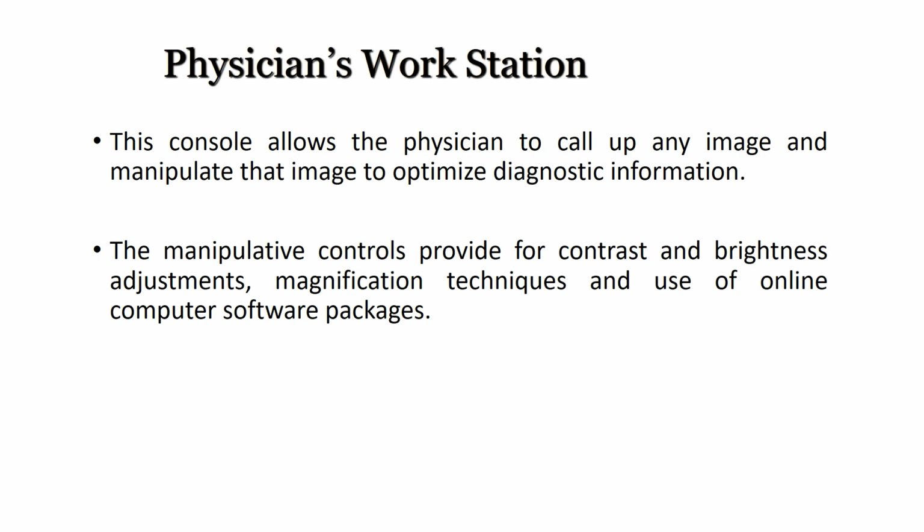Last is the physician workstation. The physician workstation is always away from the main console. This console allows the physician to call up any image and manipulate that image to optimize the diagnostic information.